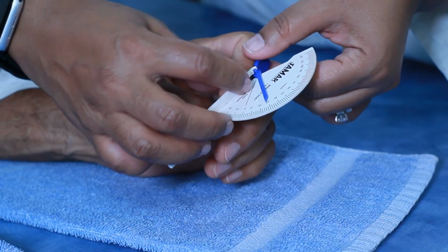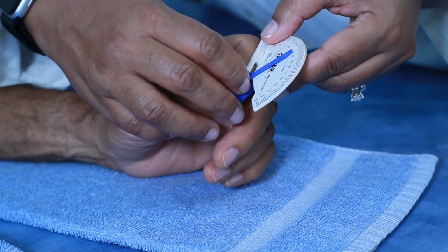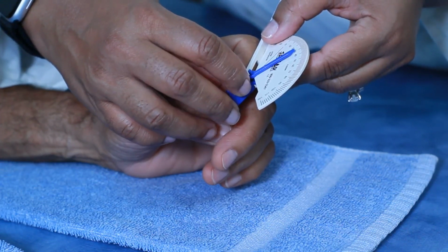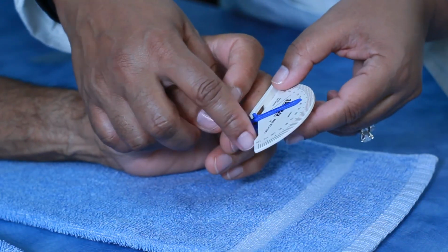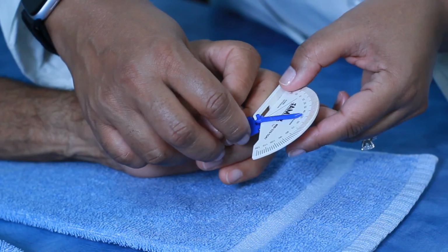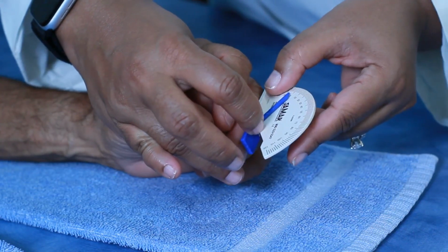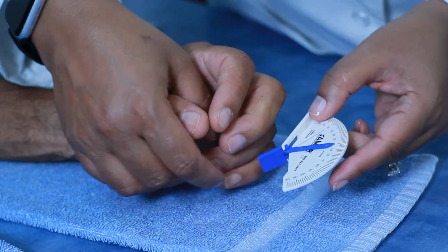And again, I've flipped it over, and sometimes you'll have to use your creativity with which end should be your proximal end or which end should be your distal end. Then we have 50 degrees at the middle finger, so from 0 to 50. There's your 0, and then down to 50.